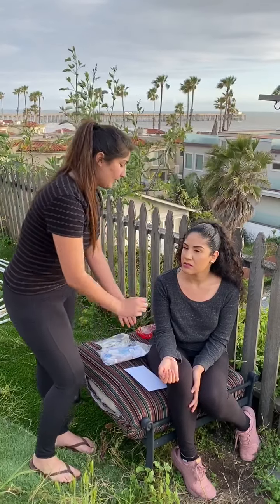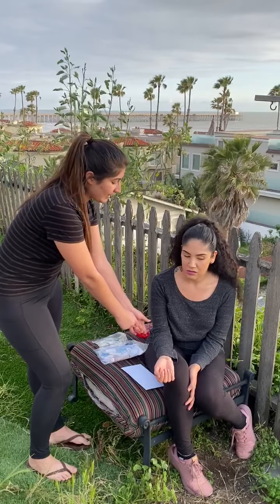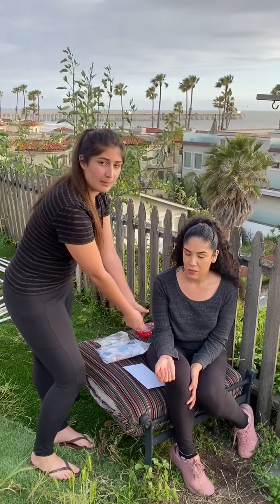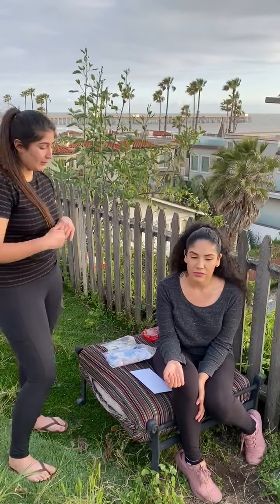I'll have my 10 milliliter saline flush, and I'll go ahead and put on gloves and assess your IV site. It doesn't look like there's any phlebitis or infiltration of any sort. So I'm going to go ahead and insert my 10 milliliter saline flush and check for blood return. There's blood return, so I'm going to flush with about 5 to 10 milliliters of saline.